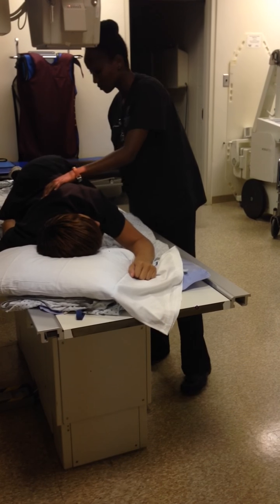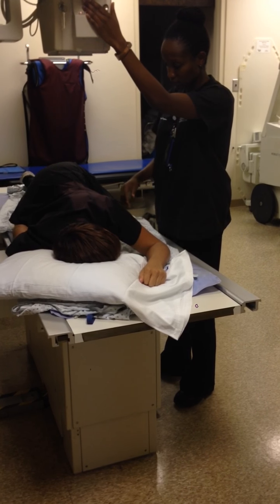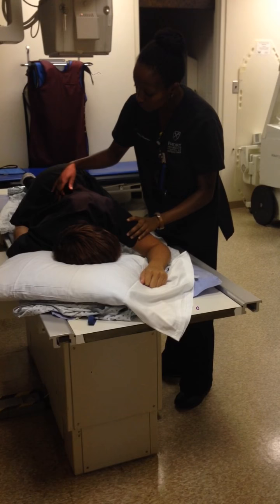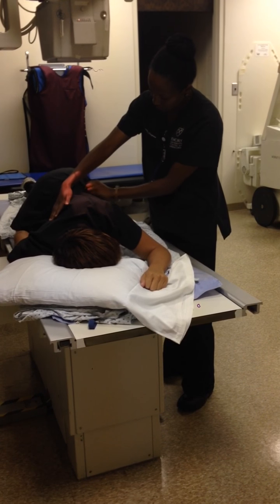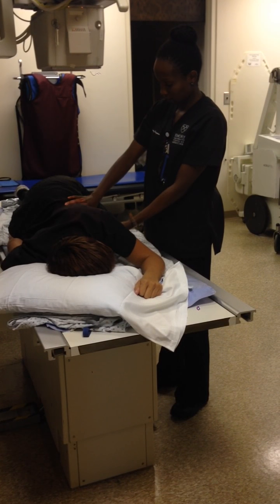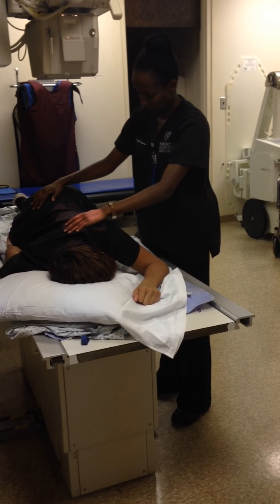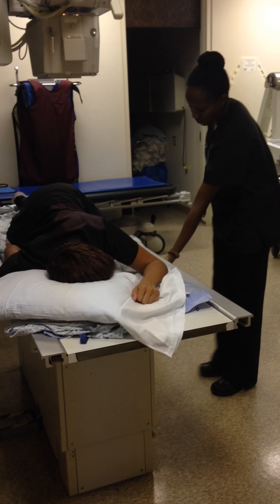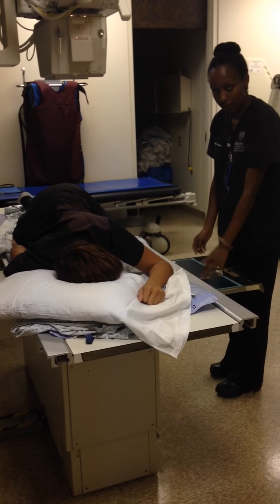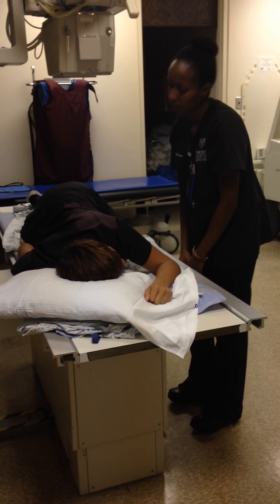Since the patient should already be in the RAO position, all the technologist needs to do is increase the patient's rotation to be between 40 and 70 degrees, depending on their body habitus. For this projection, a rule of thumb would be that the patient requires less rotation if they are smaller and more if they are bigger. The cassette used is 14 by 17 lengthwise and should be collimated to an 11 by 14 field once centering is completed.